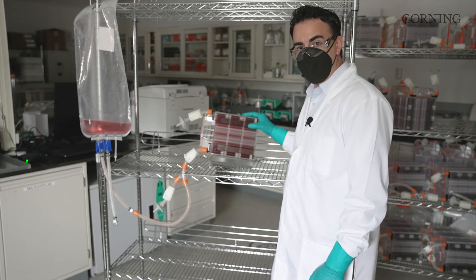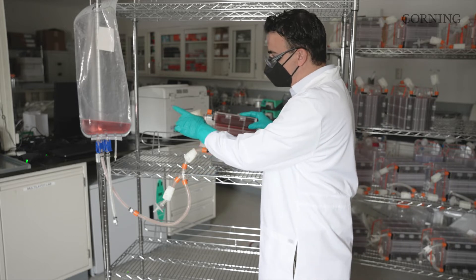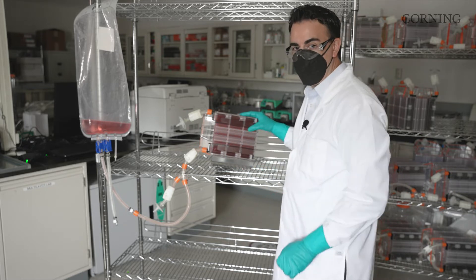Now that we've completed filling of the HyperStack 36 vessel, we're ready to chase the residual media and cells back into the bag before we move to the biosafety cabinet to make a sterile disconnect and then put this HyperStack into the incubator.